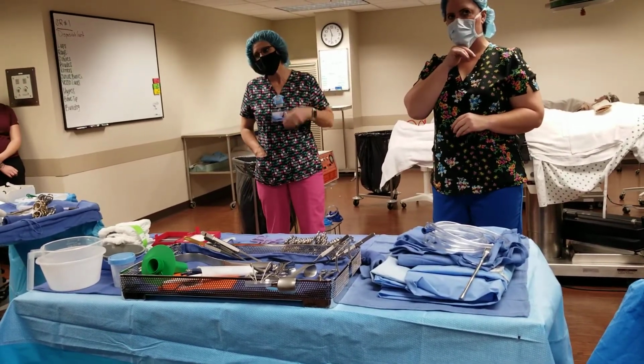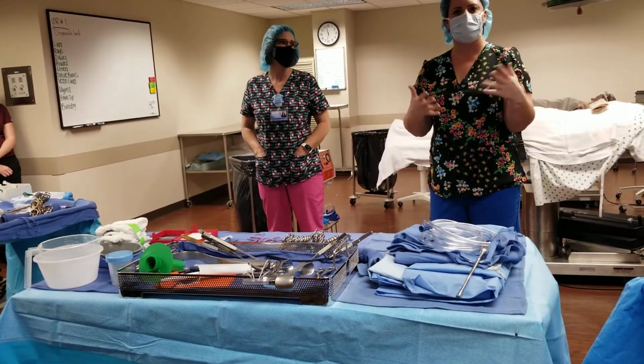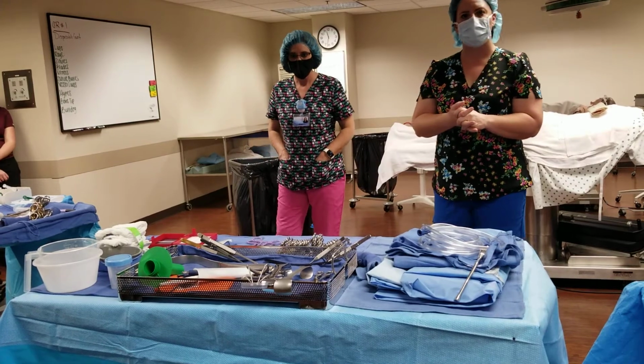So let's see, where are we? Baby's out. We clamped and cut the cord. Baby's off. Now it's time for us to just clean up and close up. At that point, they'll probably want some irrigation. They'll wash out the uterus.